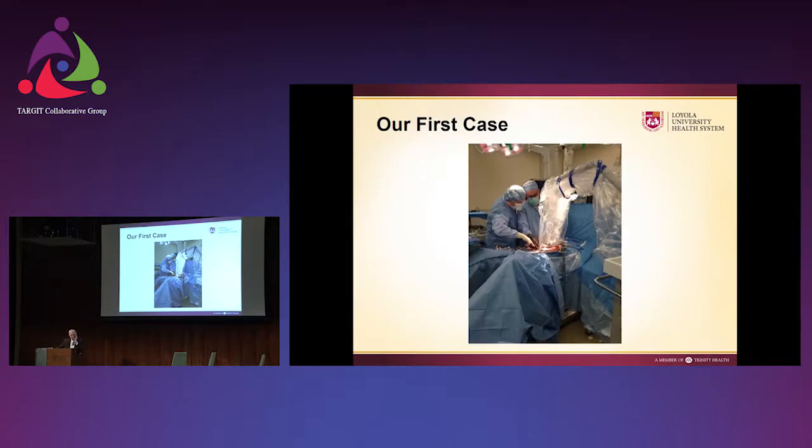And this was our first case. It's Sam Pappas, who's left the institution. We got referred this before we got the IntraBeam because it was a locally recurrent rectal cancer. And we gave 10 Gy at the surface and some postoperative retreatment. The patient unfortunately passed away from the metastatic disease, but the local area remained NED.